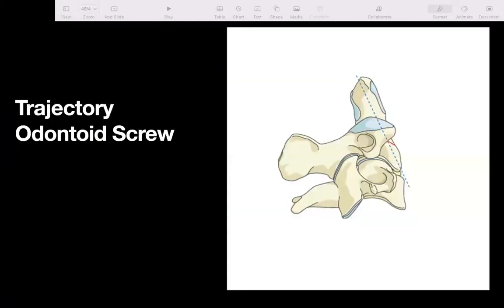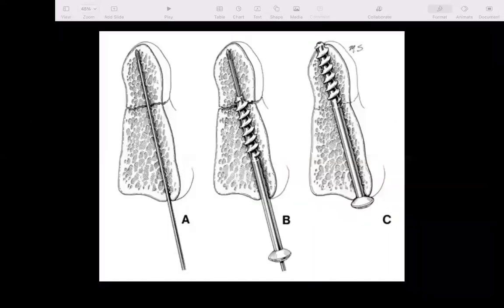This will be the ideal trajectory for odontoid screw fixation. To achieve this trajectory, we may need to remove some part of the anterior superior corner of C3 and some part of the annulus and disk. After placement of the guide wire, we drill the trajectory and place a lag screw.